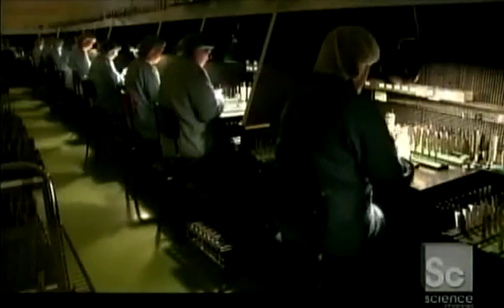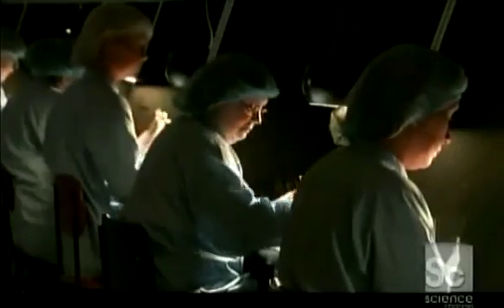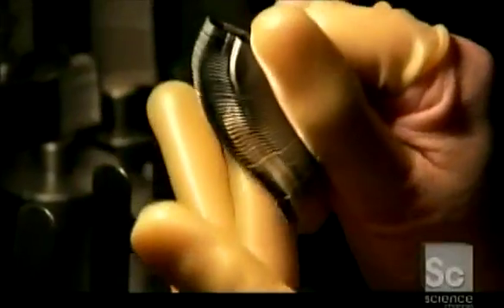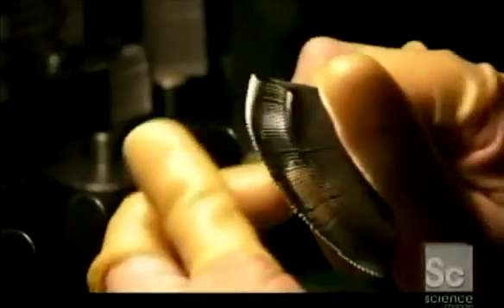After a thorough washing in an ultrasonic cleaning tank, the blades move on to final inspection. Wearing protective rubber gear, workers carefully scrutinize the cutting edges, discarding any blade that's less than perfect.